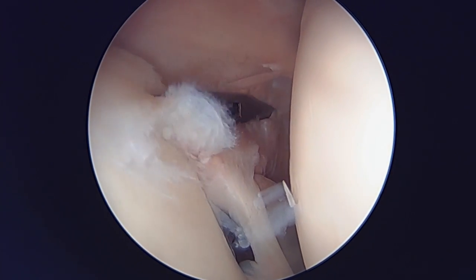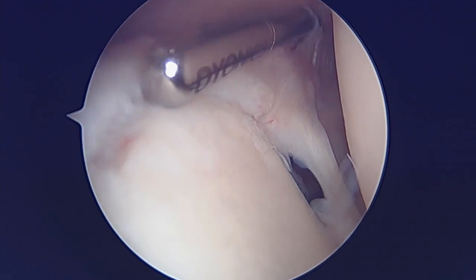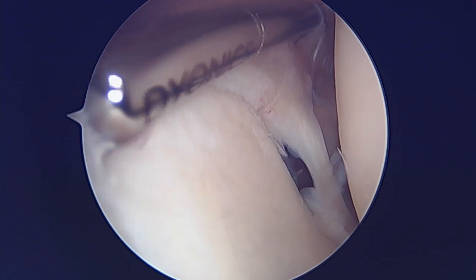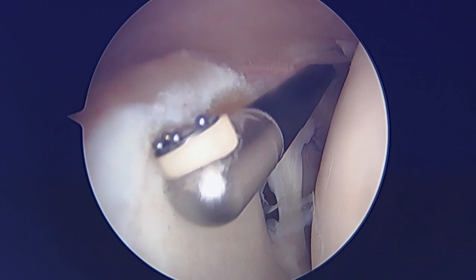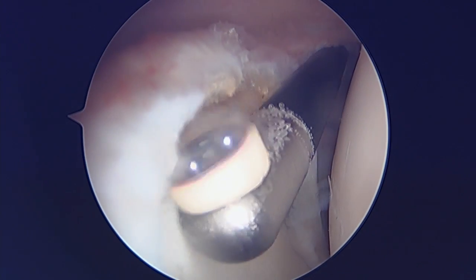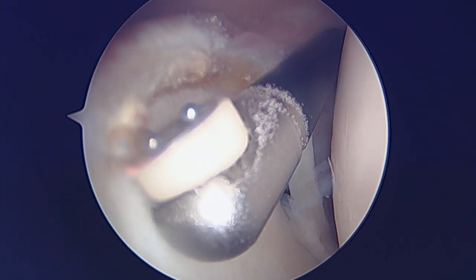Now we're going to come in and debride this superior labral tissue. I've got my shaver in, just debriding down the superior labral tissue down to a stable rim — it looks a little bit better already. Finally, I use electrocautery here just to stabilize some of these loose ends. And there you can see we've got it down to a pretty stable base of the superior labrum.